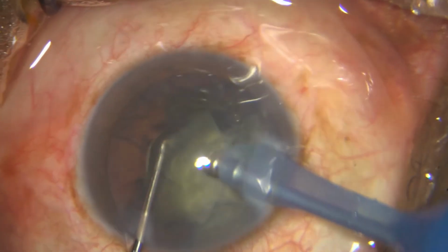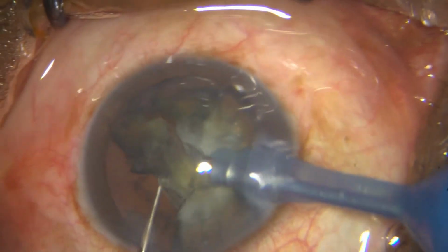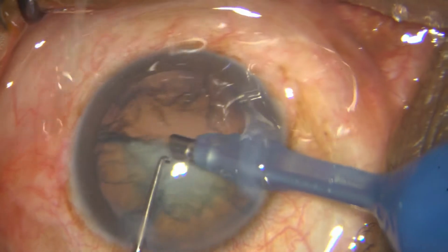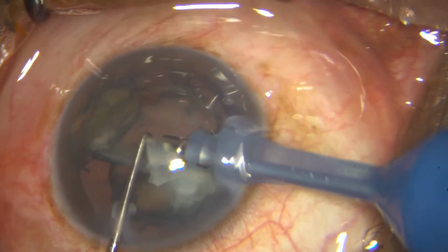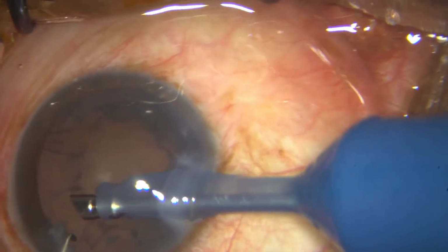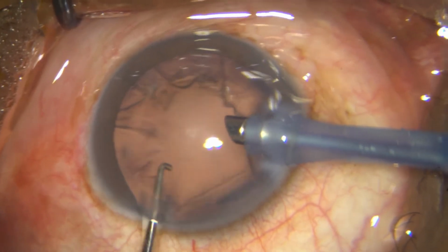So once that's done, just eat off all the segments. I think I'm using very low phaco power, and I'm at 400 millimeters of vacuum and 40 ml flow rate. I'm in continuous mode both for the chopping as well as for the emulsification and aspiration of the pieces. Usually a small piece gets stuck in the paracentesis, get it out.